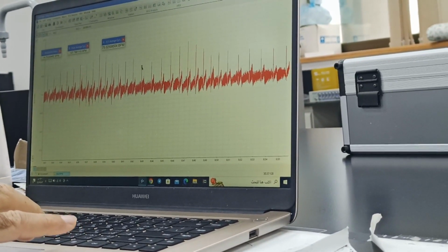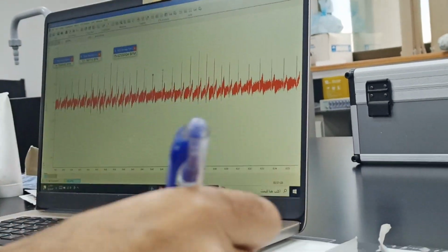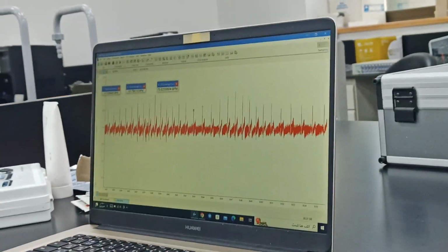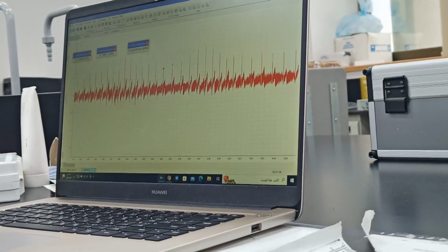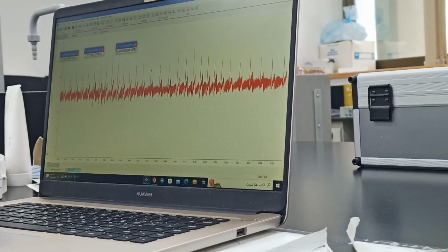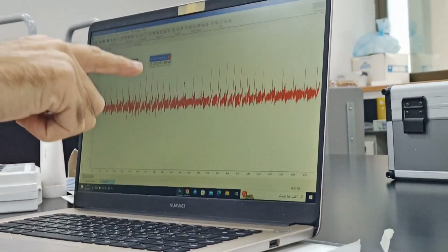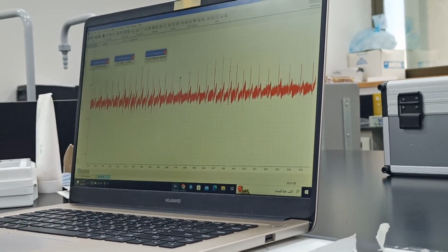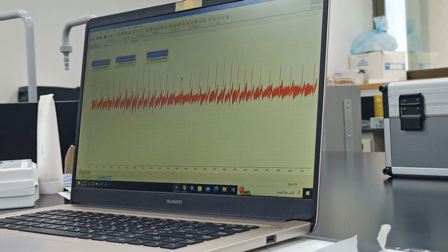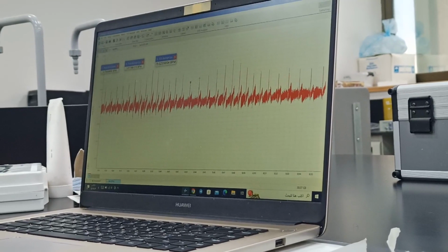And this is now the time. 78, yeah, it was 78. And now the time interval is 0.994. 60 over 0.994. Okay. So how much is the difference? Here it is 76 and at another place it is 60 beats per minute. This is the instantaneous heart rate, at that particular instant.